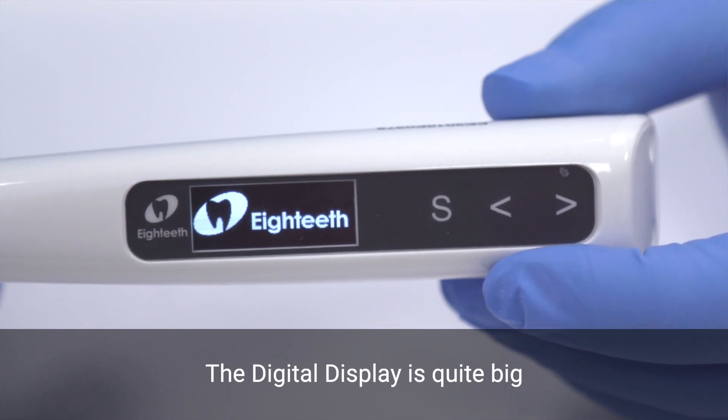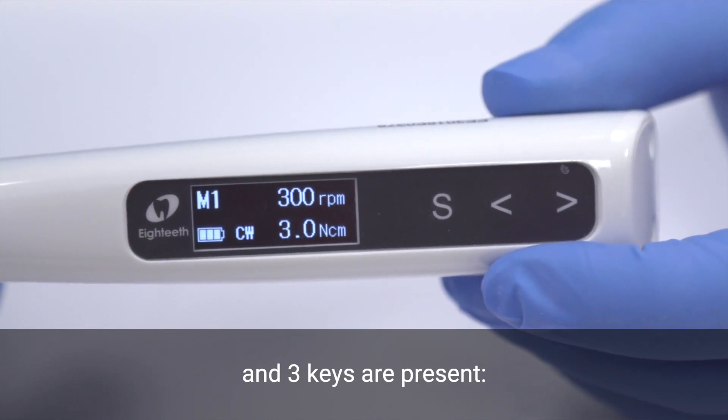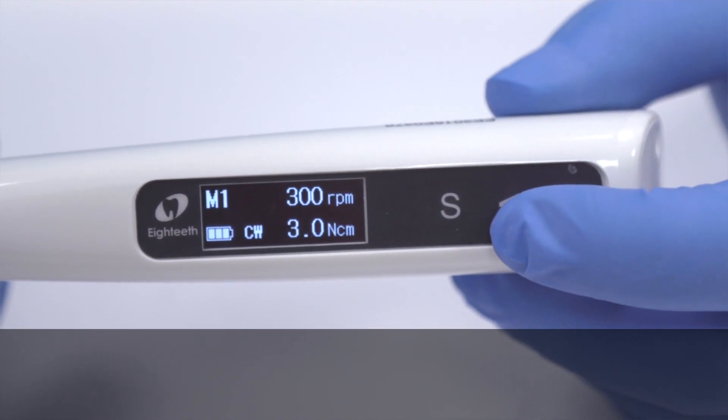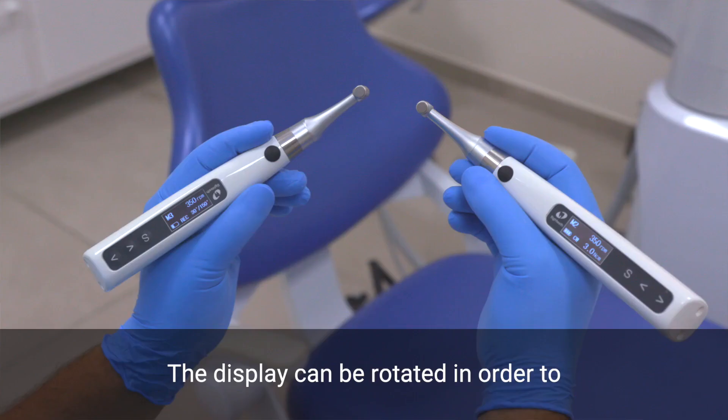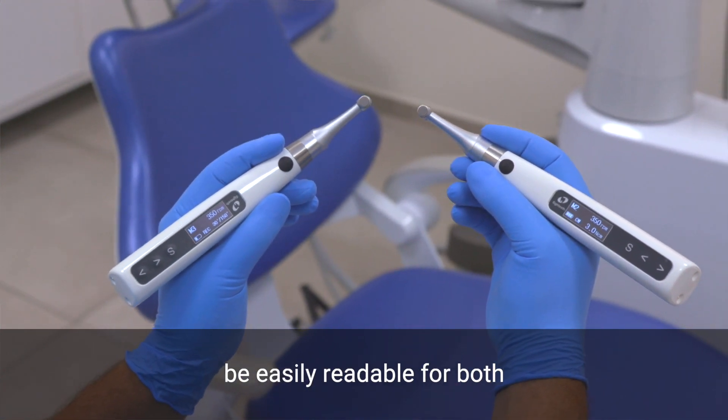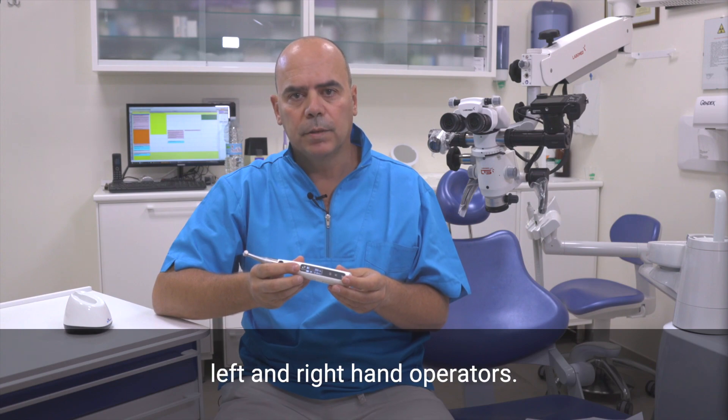The digital display is quite big and three keys are present: the setting key, the decreased key and the increased key. The display can be rotated in order to be easily readable for both left and right hand operators.